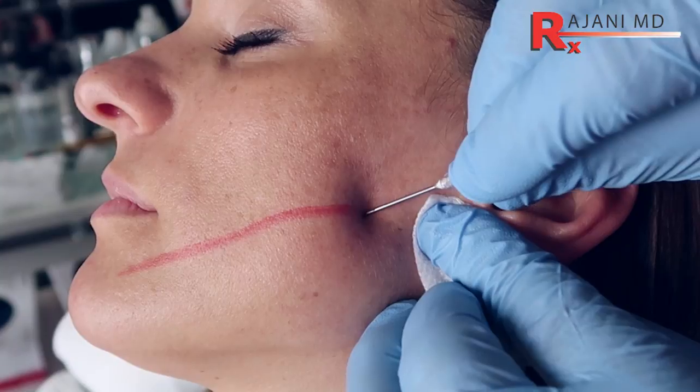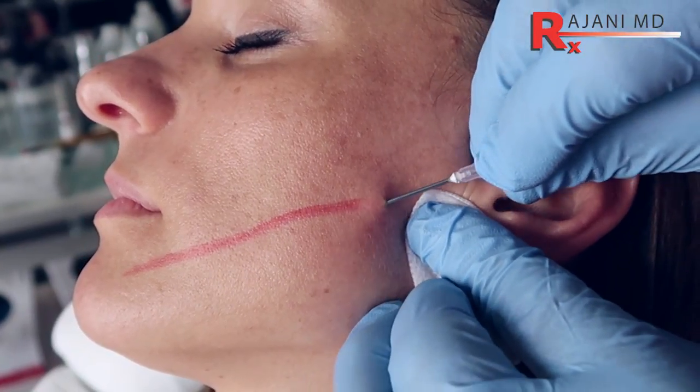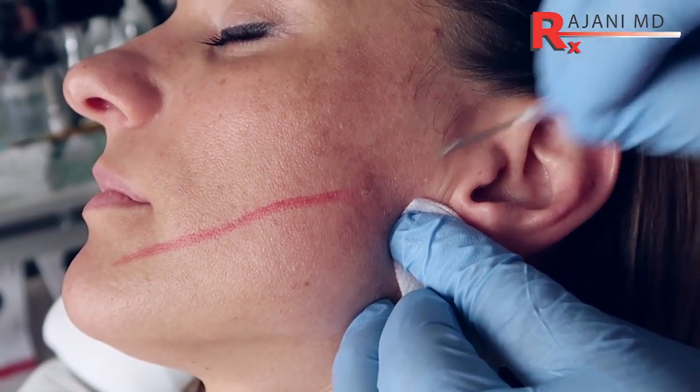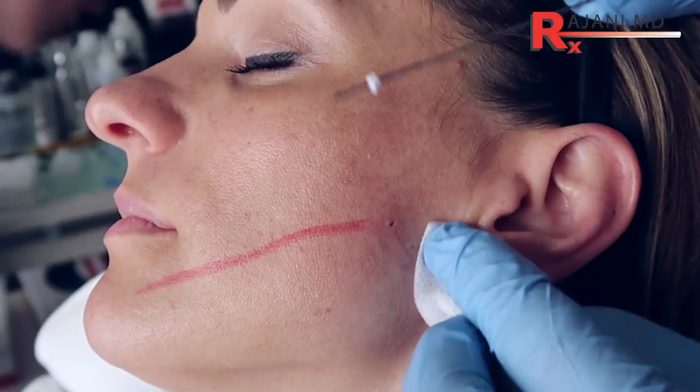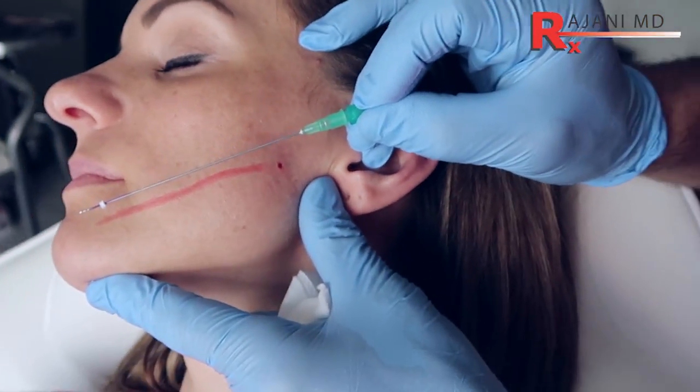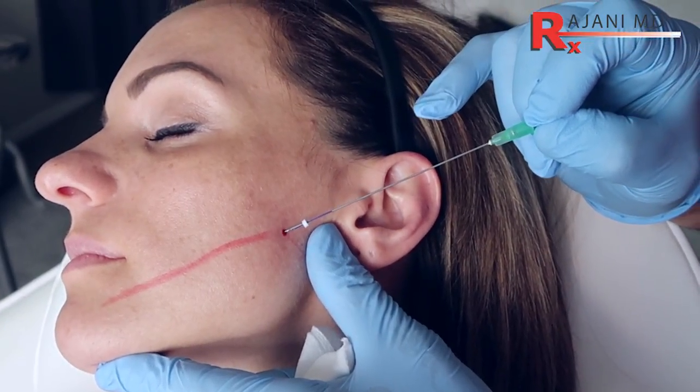For me, the initial ones — how we place them going in the skin and out the other side — the tensile strength created some irregularities in the skin, and some side effects are being slowly worked out like every other treatment. I'm really excited about the new Barb 4. It has a full cannula on it, full length, blunt tip, and the exit point is distal, more proximal from the tip — it's separate. It's not a half cannula like some of the threads we used to put with the bevel down, so the thread was a little deeper.